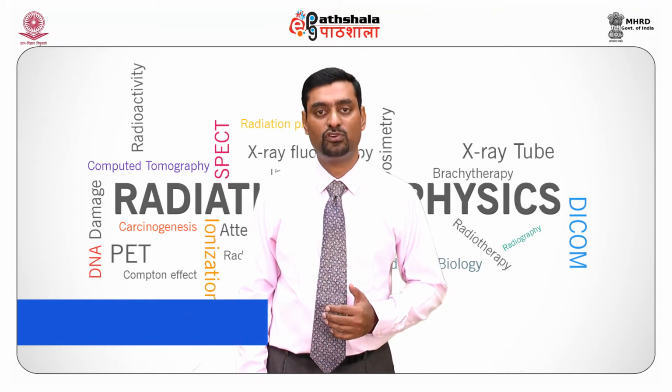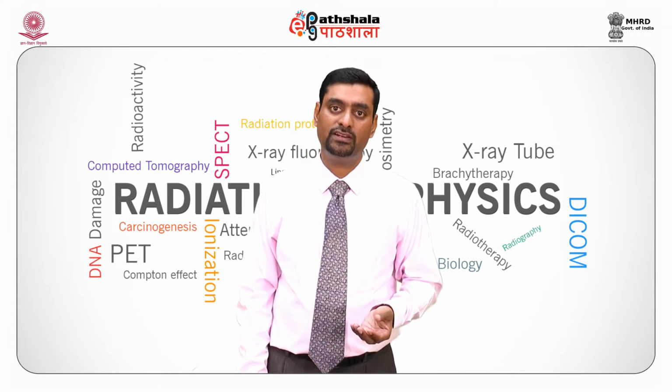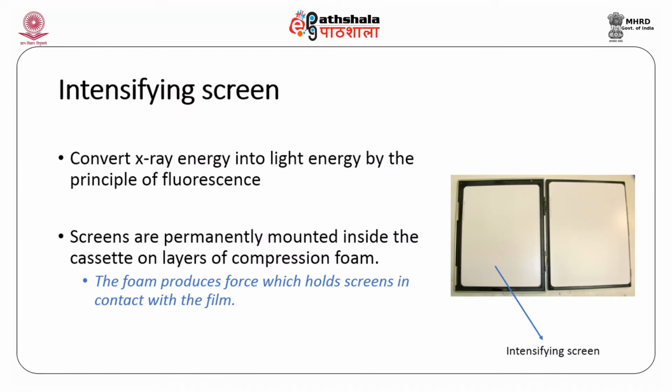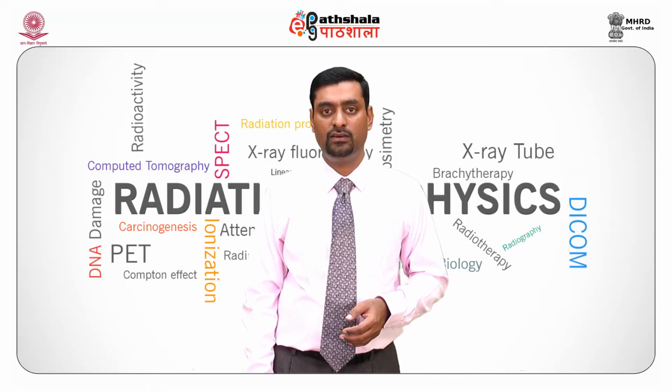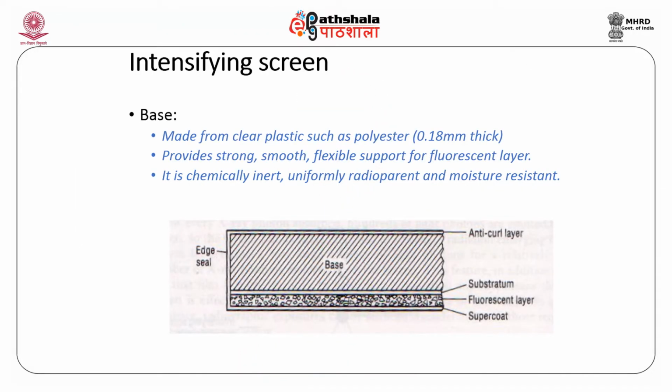Using this kind of fluorescent material, it is possible to produce high quality images in a very short duration of time. Screens are permanently mounted inside the cassette on layers of compression foam. The foam produces force that holds screens in contact with the film. The intensifying screen has a base made from clear plastic such as polyester, 0.18 millimeter thick, which provides strong, smooth, flexible support for the fluorescent layer, and should be chemically inert, uniformly radiolucent, and moisture resistant.